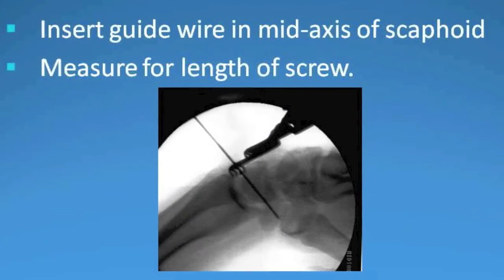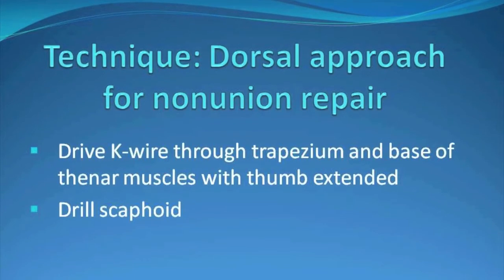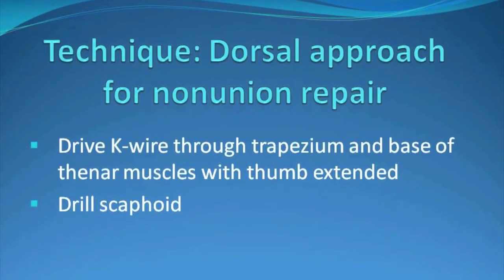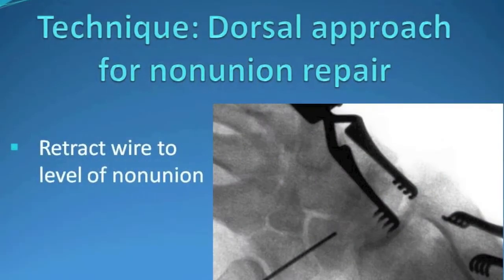The guide wire is inserted to a center axis position within the scaphoid, after which time depth measurement is made, and the guide wire is then driven through the trapezium and out the base of the thenar muscles with the thumb extended.